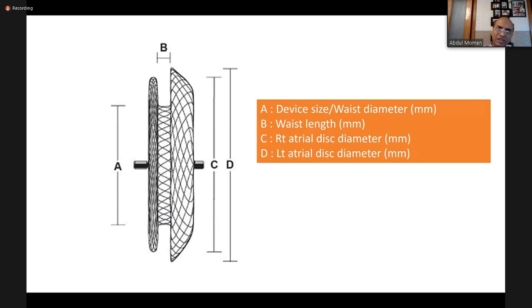At the age of 72 years, a suspected case of a paradoxical embolization, I have closed the ASD of 32 millimeter with a 38 millimeter. So this is required. This is necessary. So RARV dilated, pulmonary pressure is not raised. ASD should be closed in every patient.